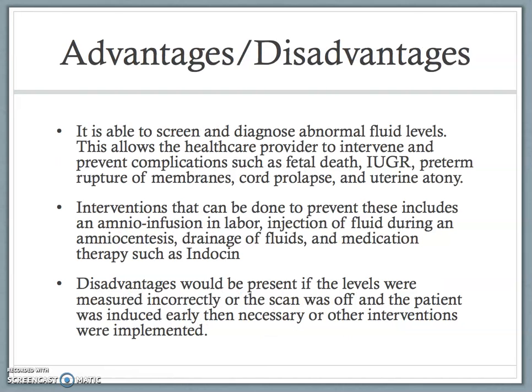It is able to screen and diagnose abnormal fluid levels. This allows the healthcare provider to intervene and prevent complications such as fetal death, IUGR, preterm rupture of membranes, a cord prolapse, and uterine atony.